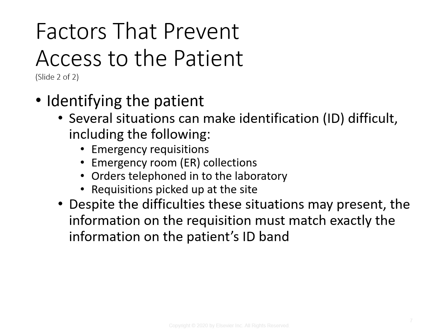Identifying the patient. As you learned earlier in previous lectures, positive ID of the patient is the most important procedure in phlebotomy. If there are any discrepancies, we have to resolve those before collecting the specimen. If you look at the wristband and it doesn't match your labels, you need to remedy that. If the patient gives you a different birth date than what's on their wristband, you also need to make sure that nursing or somebody is aware of that, because that is not correct either.